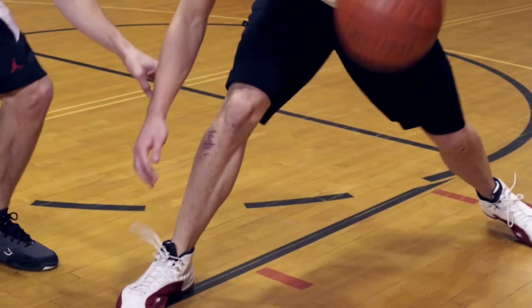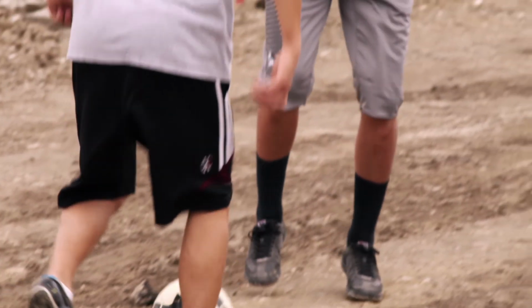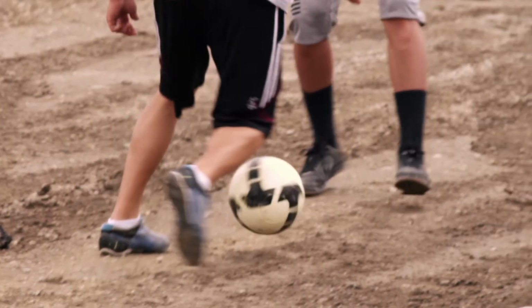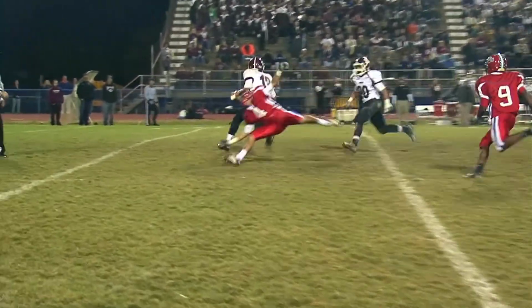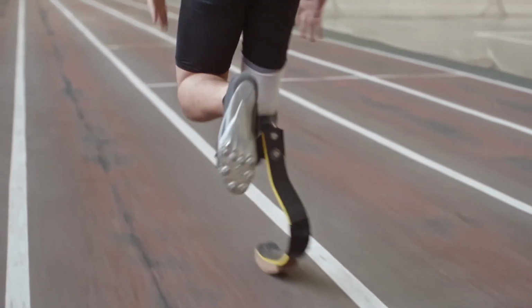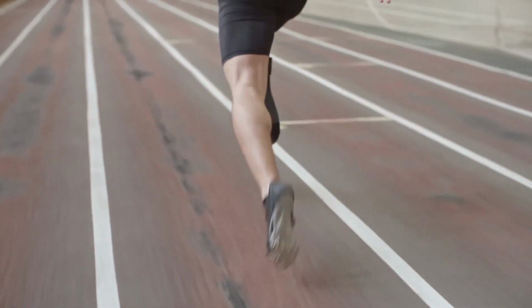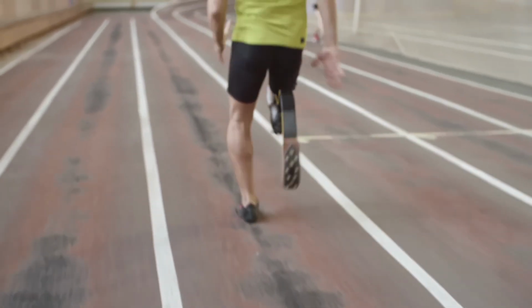Also, activities that could create sudden twisting or bending forces or torque on the implant are not recommended. High-impact sports are discouraged. If an impact sport is engaged in, it is recommended that a protective socket be manufactured by a prosthetist to distribute the loads to the soft tissue as well as the implant. With regards to running, there is no official stance on whether or not you are allowed to run. High impact is discouraged within the system. However, if some light running is to be participated in, it is recommended that the patient wait a year for full bony integration to take place.